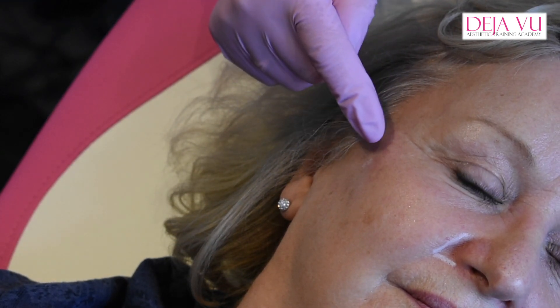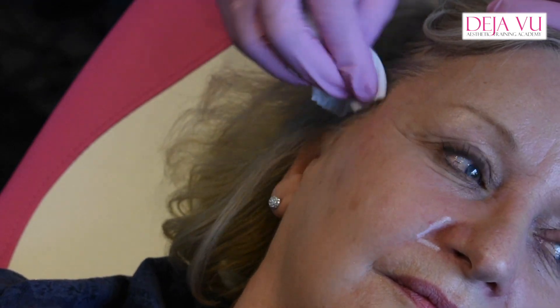The reason you have to put this deep — if you didn't, because it's got that G prime, resistance to deformity — you would end up with big lumps if you put it too shallow. You can see there's a couple of little bumps there, and I can just sort of massage that down.